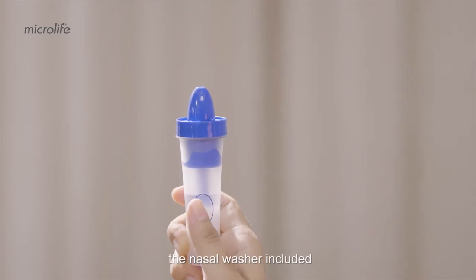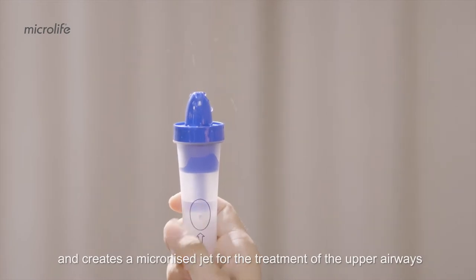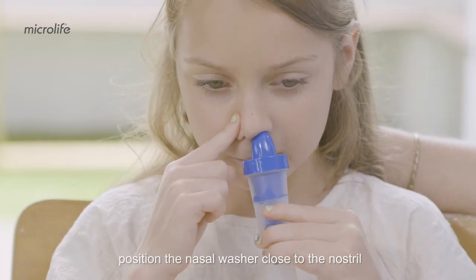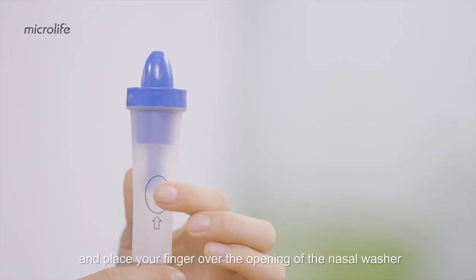The nasal washer included helps to moisturize the nasal mucosa and creates a micronized jet for the treatment of the upper airways. Fill the nasal washer with saline solution. Position the nasal washer close to the nostril. Turn the device on and place your finger over the opening of the nasal washer to start the treatment.